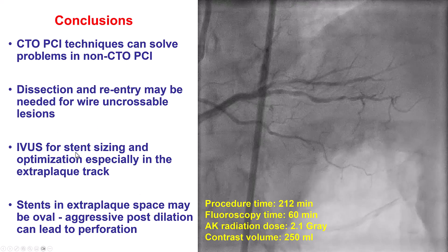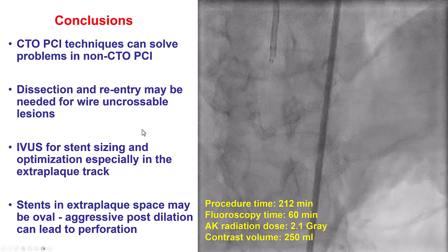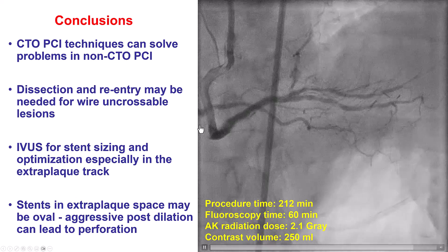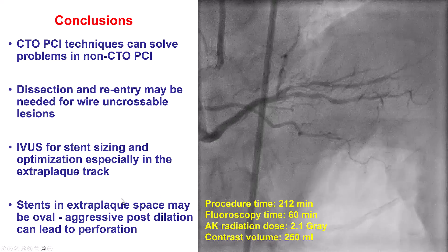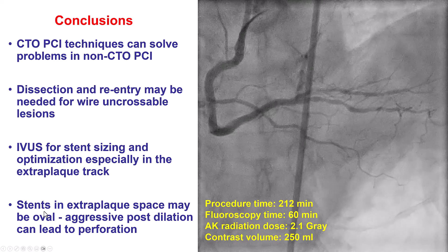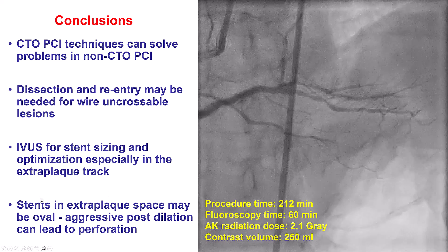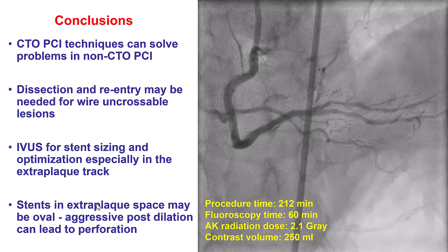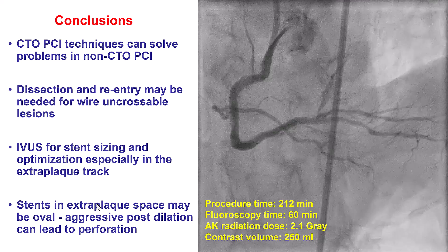For cases like this, IVUS is critical — as it is for every complex PCI — to ensure a good stent area is achieved. In cases with heavy calcium, when stenting into the extraplaque space, the goal is not to make the artery perfectly round. An oval shape is perfectly acceptable, because one can only expand in one direction with heavy calcification. If we are too persistent with high-pressure balloon inflations, we risk coronary perforation.